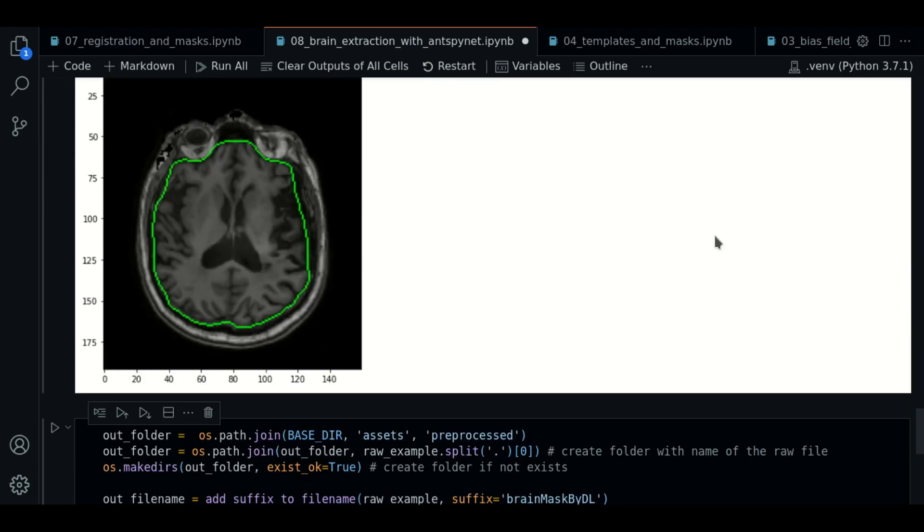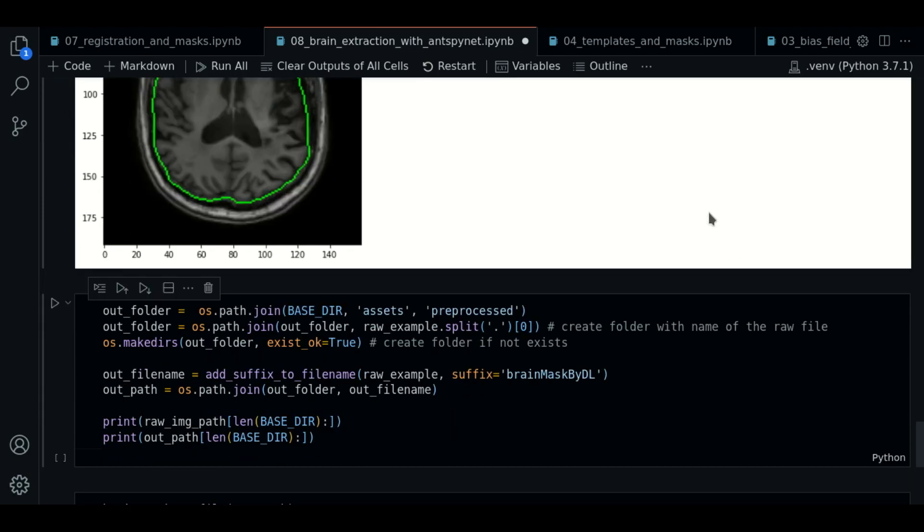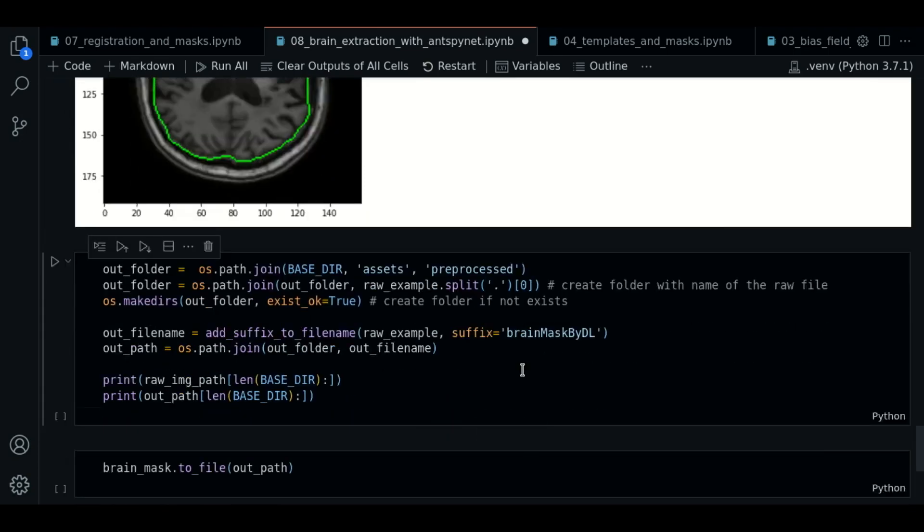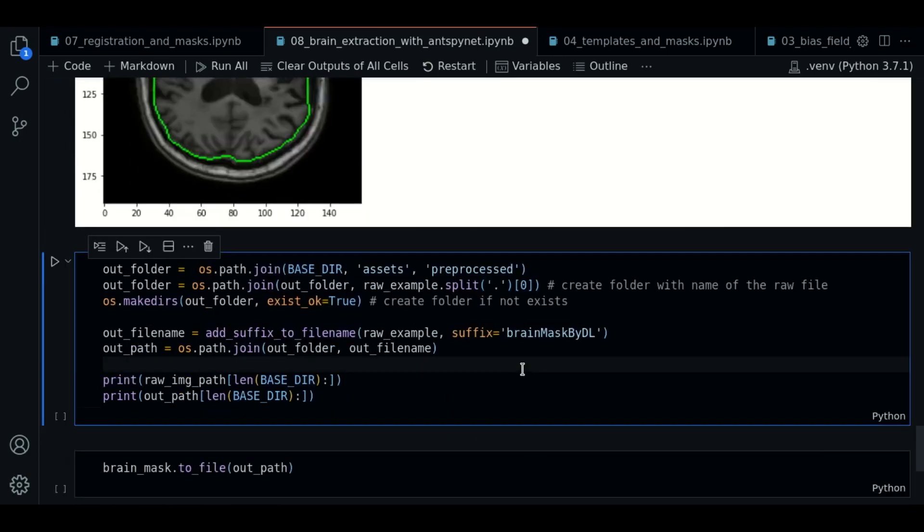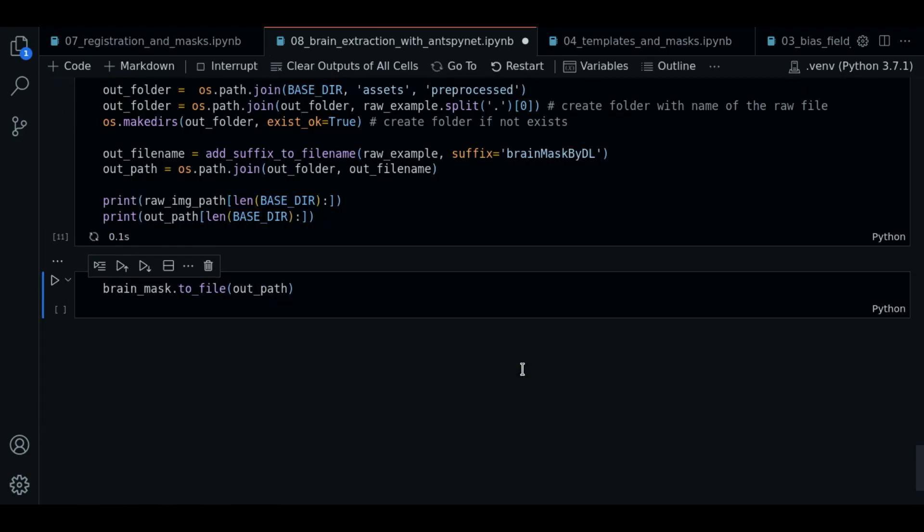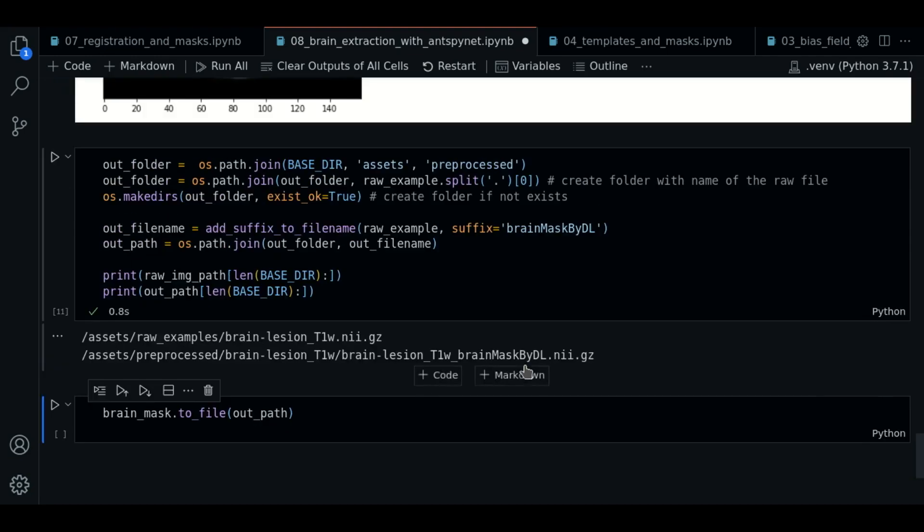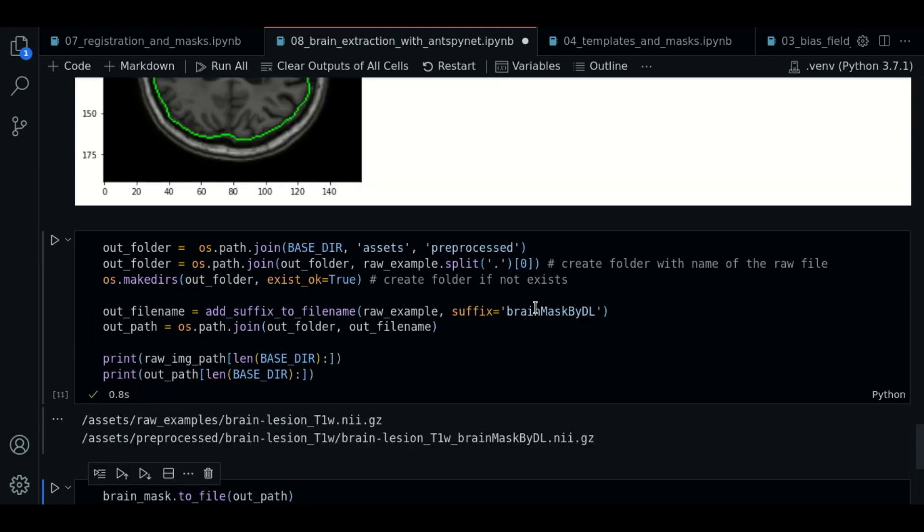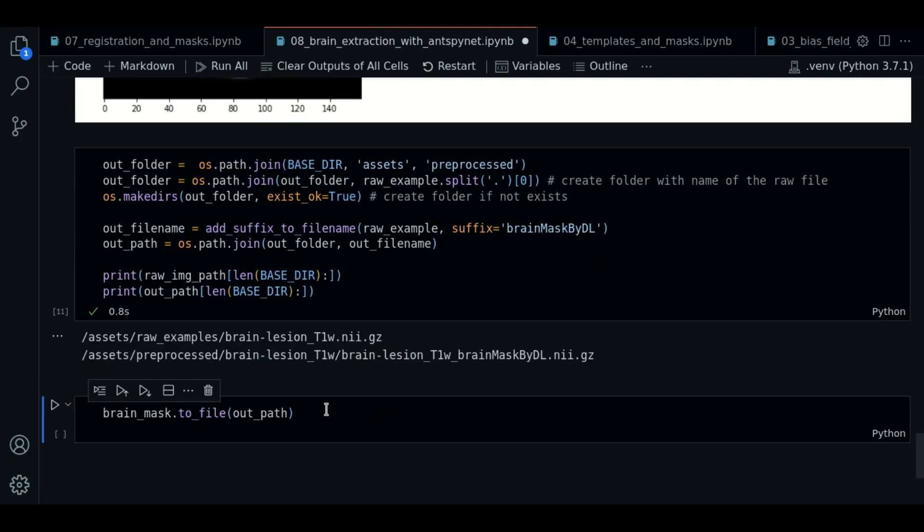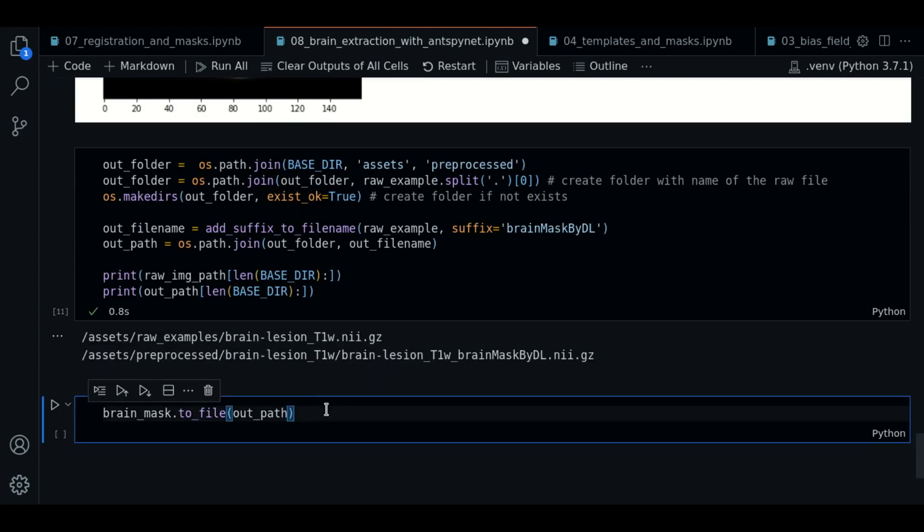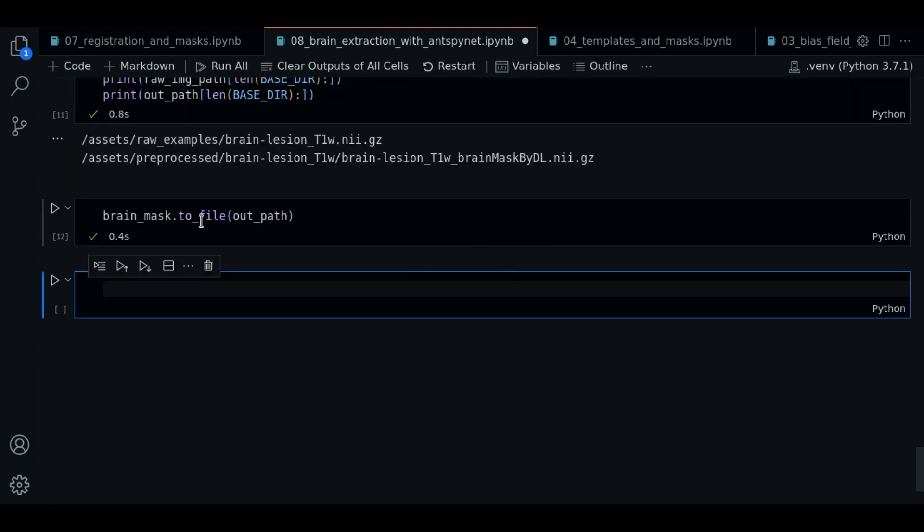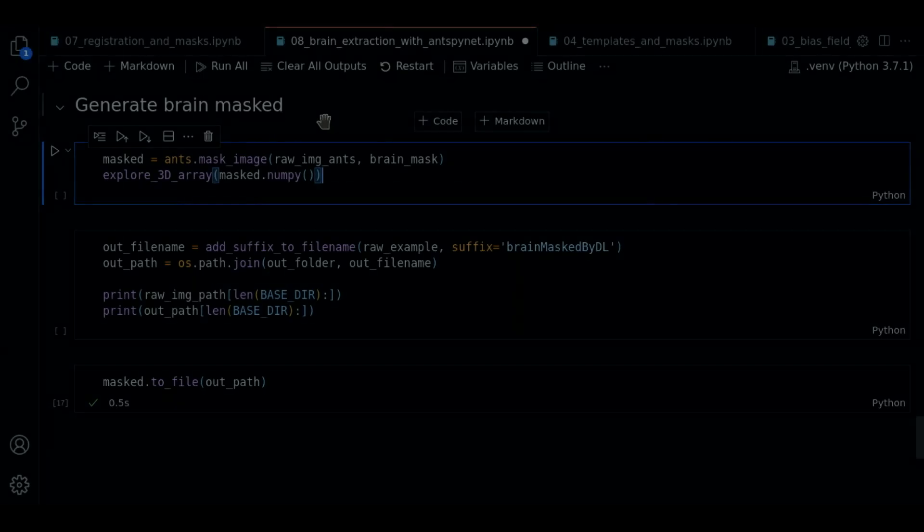So the next thing we're going to do is to save the result. We're going to generate the path in the same way as before. This time, brain mask by DL. We're going to call the save method to save the file.